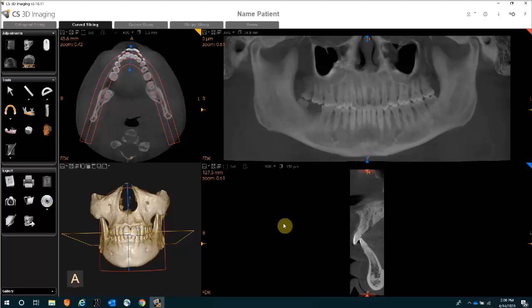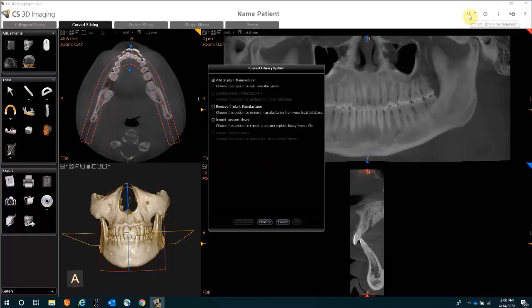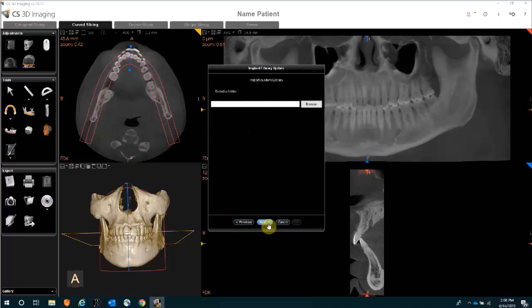If there's an implant library that is not available in the software but you have it saved on your computer, you are able to import your own personal library. Go back to the same icon to manage your library, select the option to import a custom library, click Next, browse to the location where you have your implant library saved, select that folder, click Next, and your personal implant library will be uploaded.